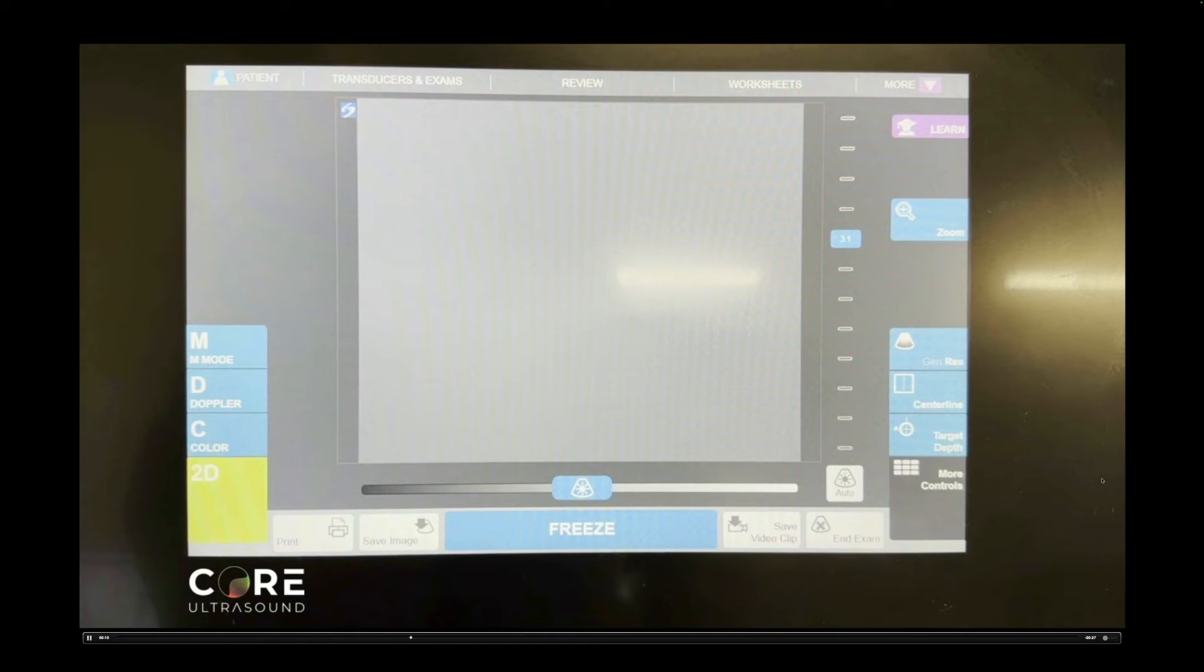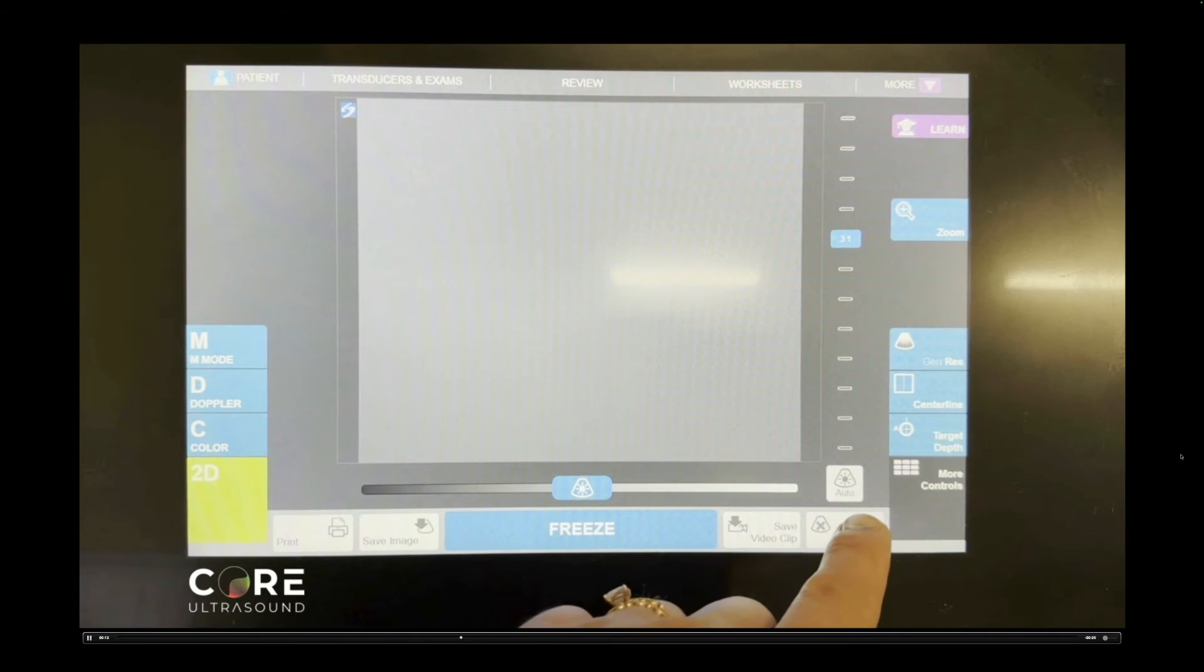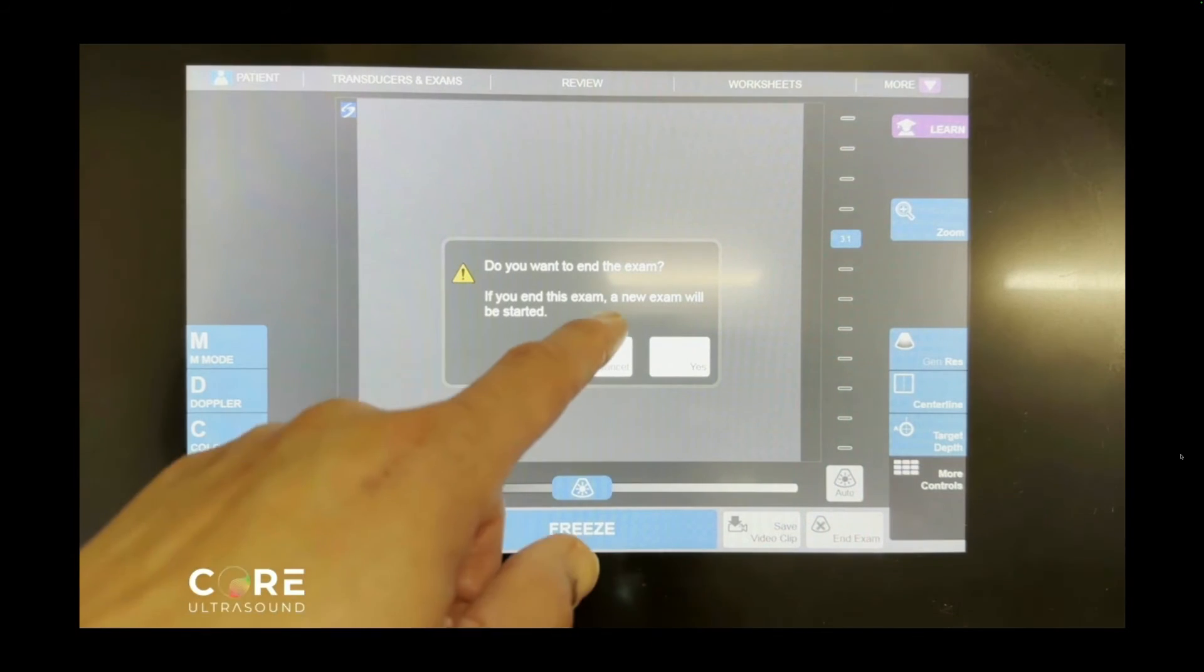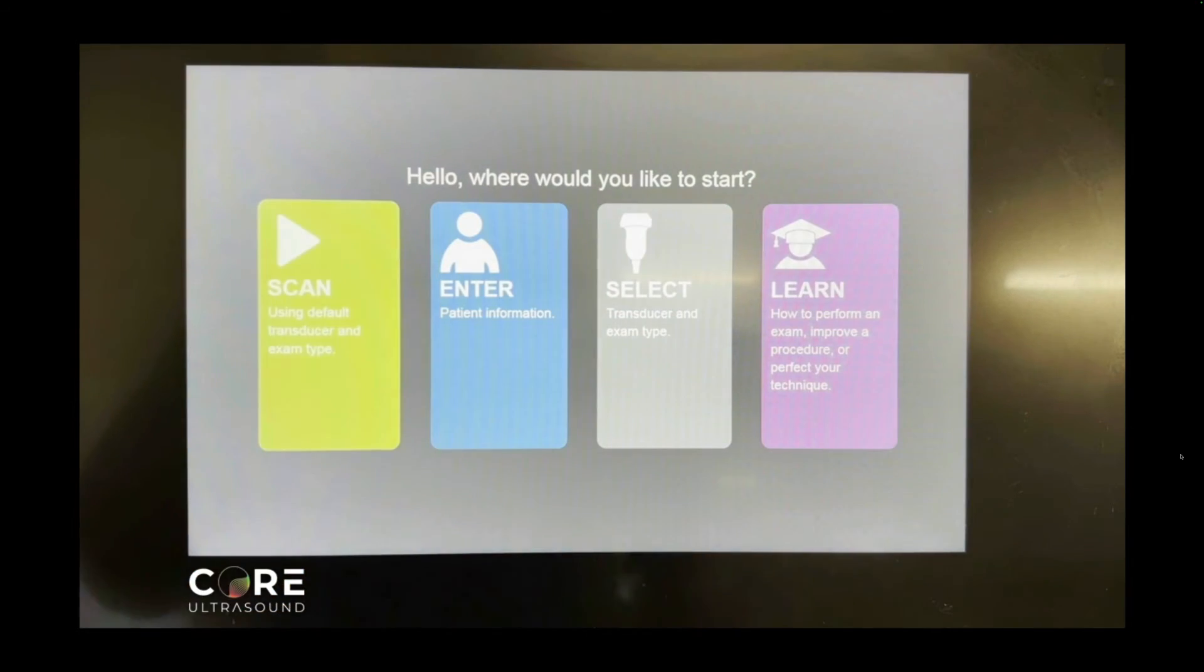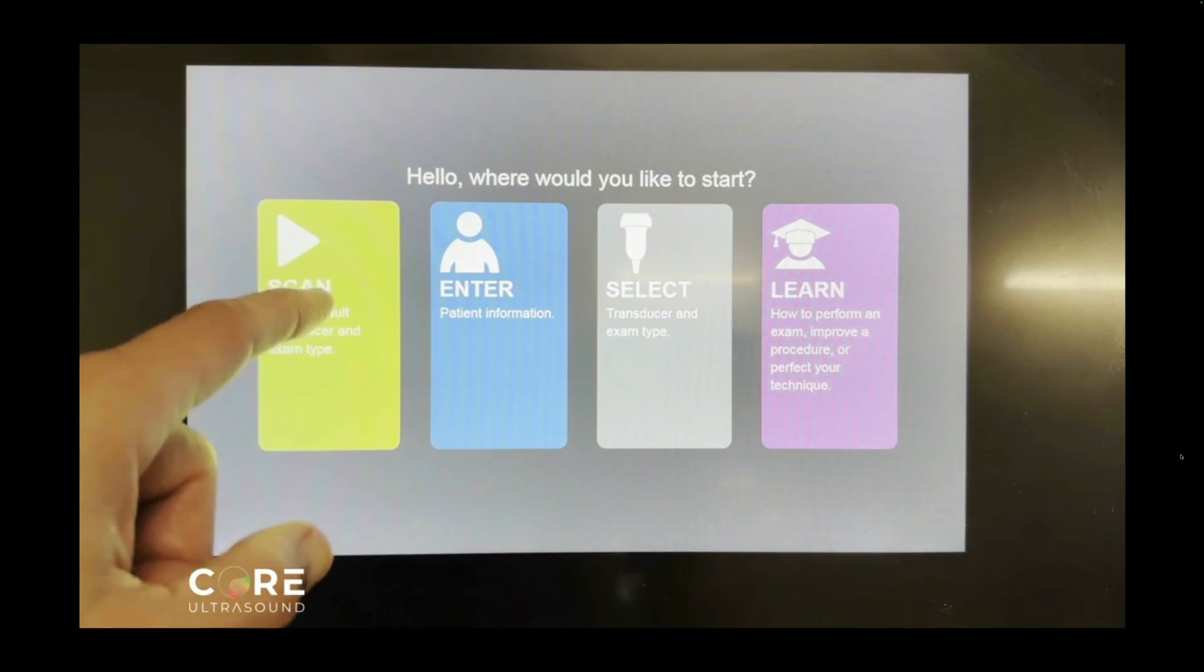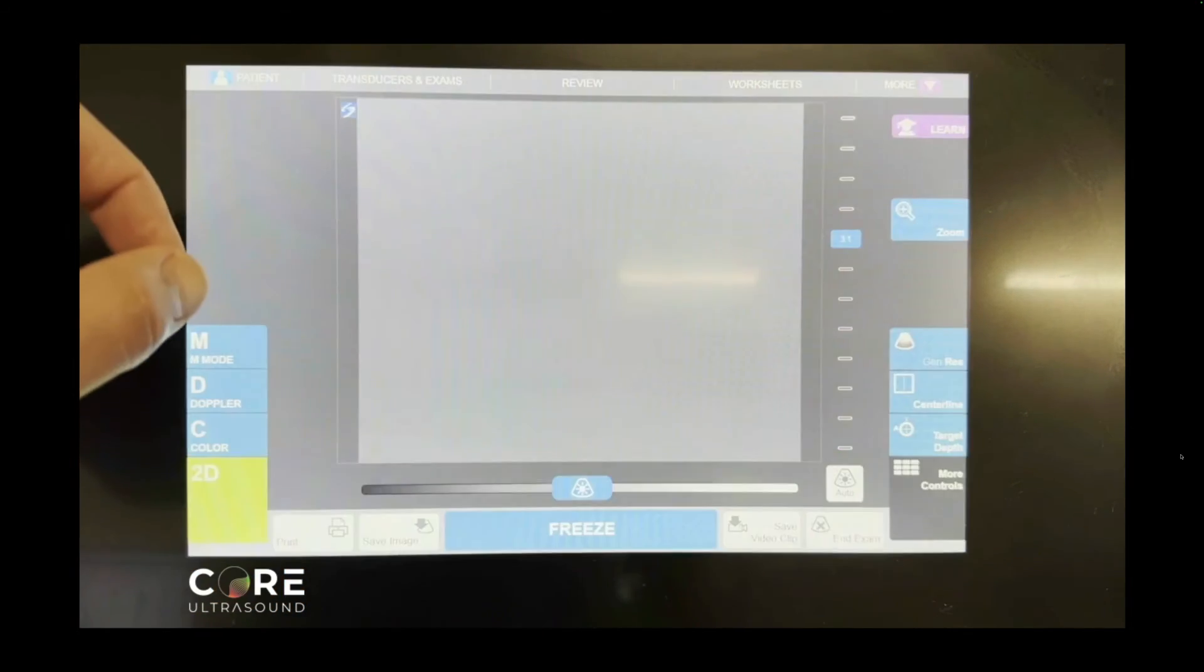Now, when you're done doing your exam and you're ready to end it, you hit end exam, you're going to hit yes. And then it's going to take you back to this page.